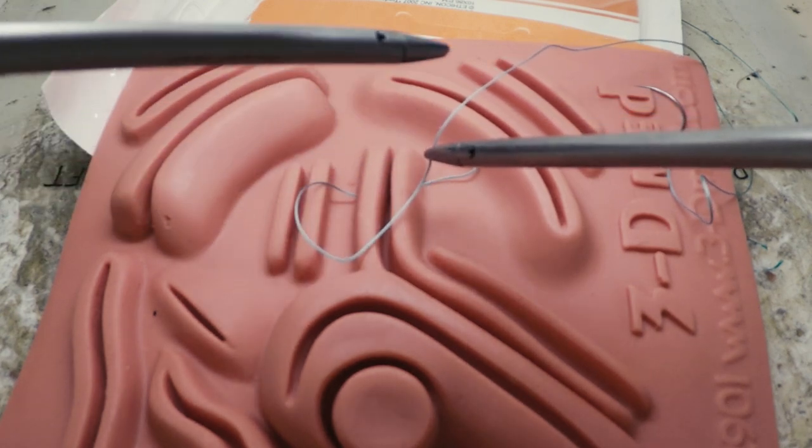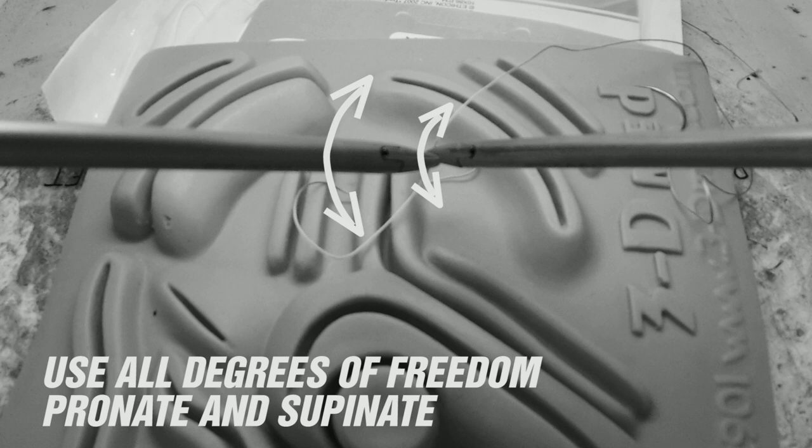When working laparoscopically, you should be using all your degrees of freedom to make your life easier. In addition to moving your instruments in and out and pivoting at the port, it's important to supinate and pronate to create the biggest loop through which your left hand can travel.